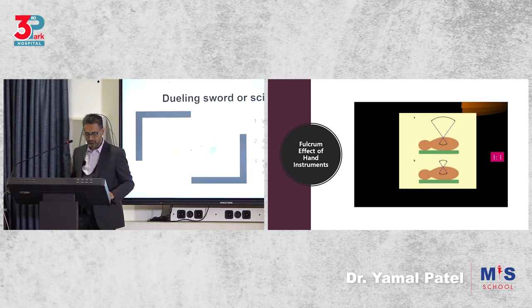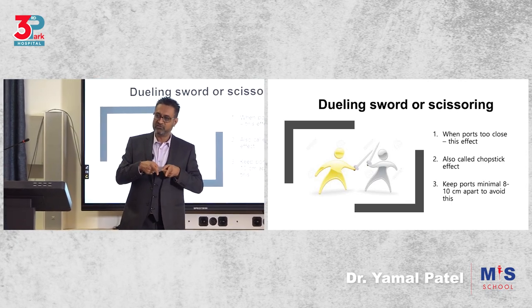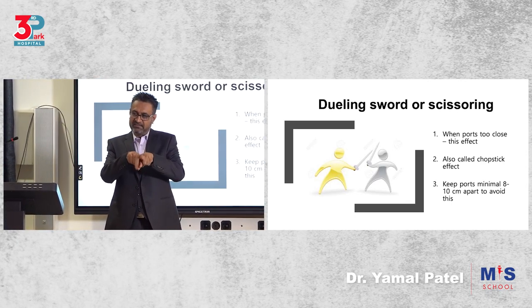Okay? Next thing, don't put two ports too close to each other. You'll get the chopstick effect.